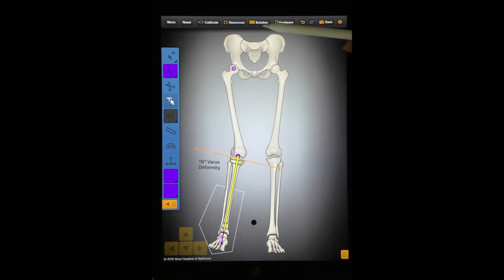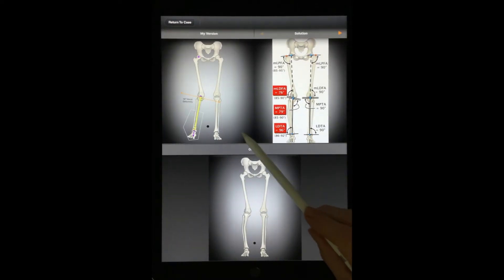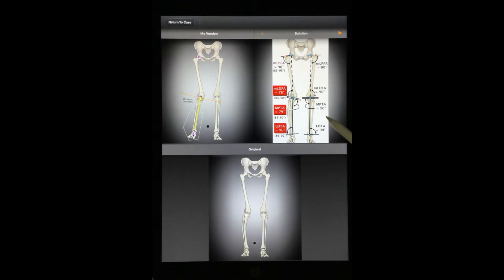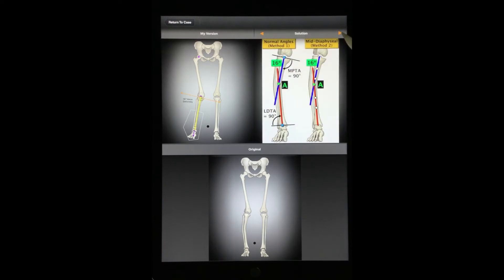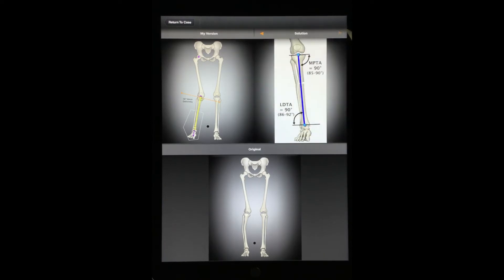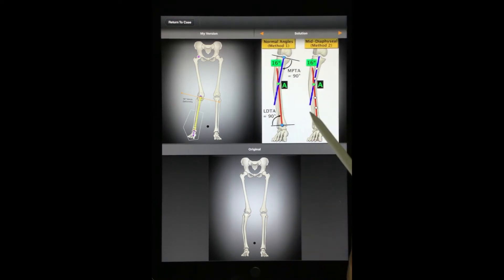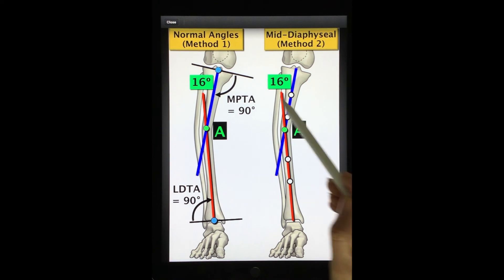Press the Solution button to compare your work to a preloaded case solution. This button will also allow you to compare a case that you loaded into Bone Ninja. In this situation, you will be able to compare the image with your work to the original version of that image and the planning solution provided for the case. You can double tap or pinch to zoom into an image.